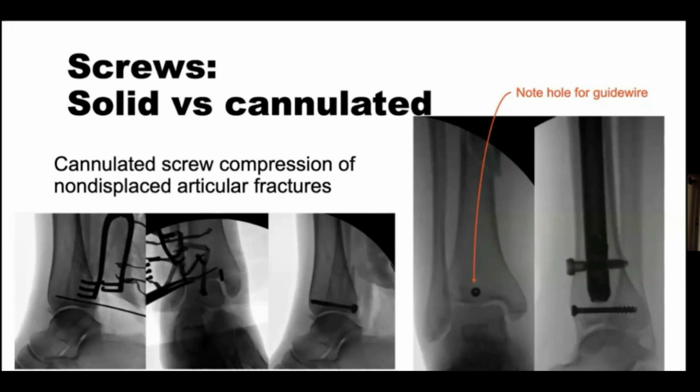So this surgeon has decided to put in a cannulated screw to help keep that fracture non-displaced while the tibial nail is being placed. And so first goes the guide wire, which is what you see in the left-sided picture, and then you can see this A to P.